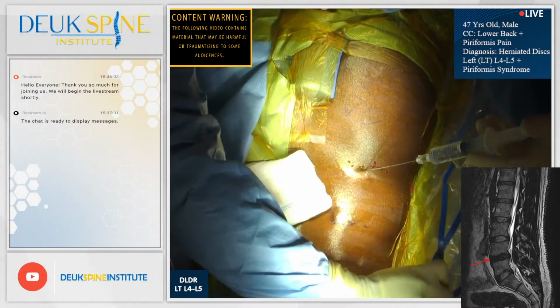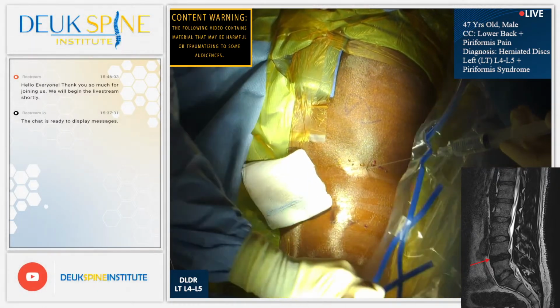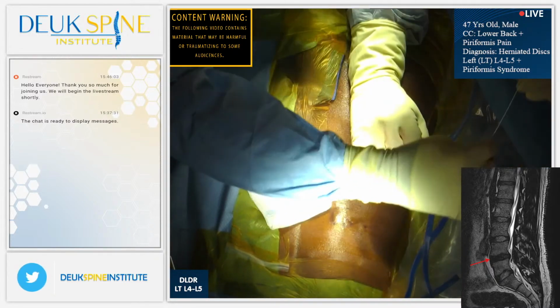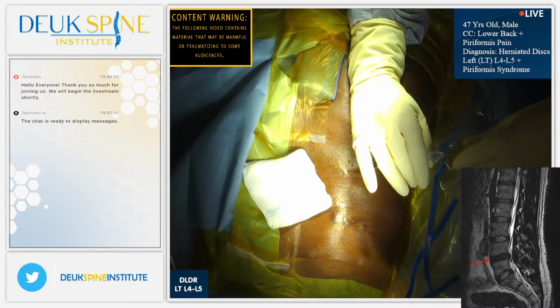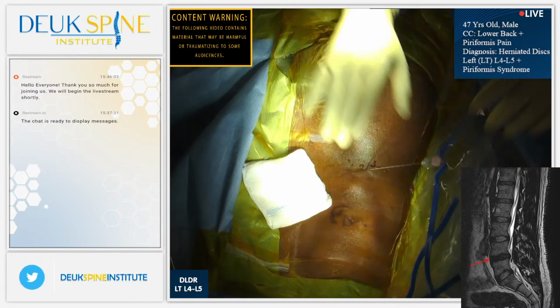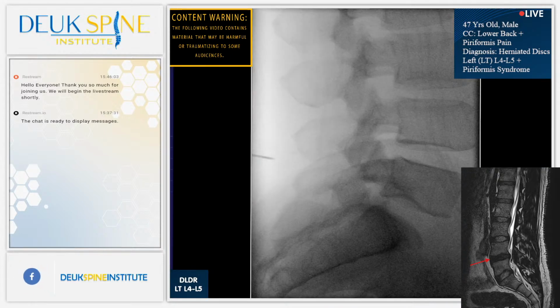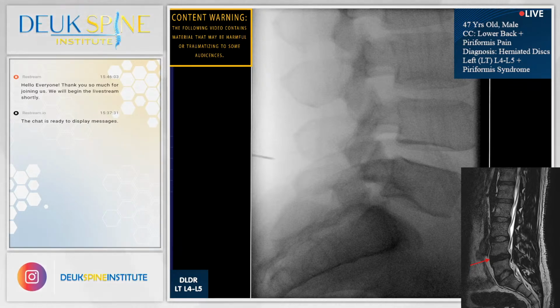All right, not bad. I'm putting in some numbing medicine in the skin and muscles so that it's more comfortable for the patient. That will reduce his cardiovascular response. Okay. Looking good. Might reposition a slight bit north. Any questions, feel free to ask me.